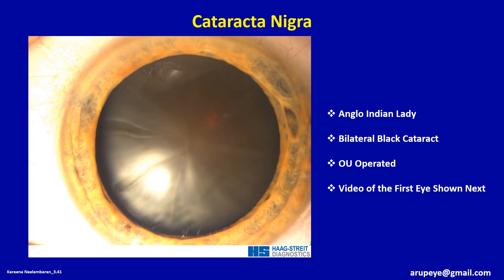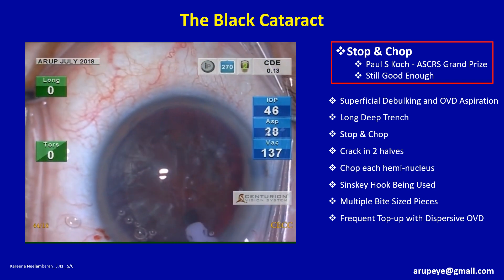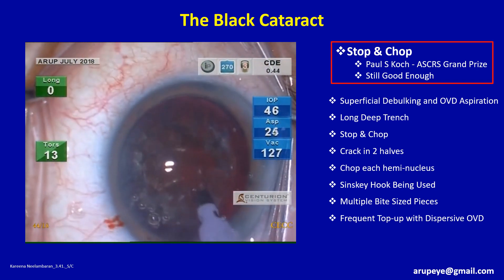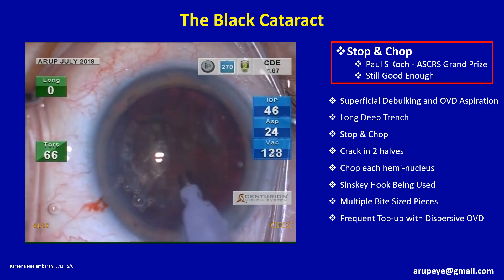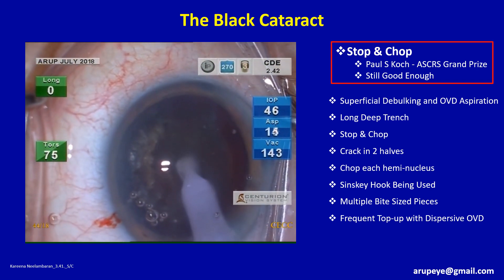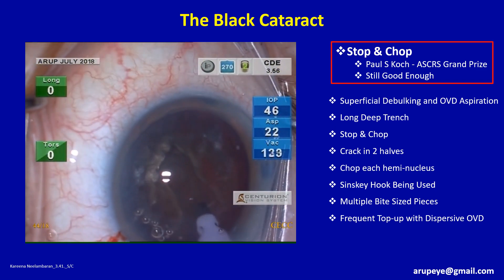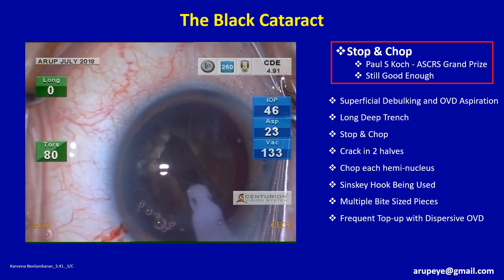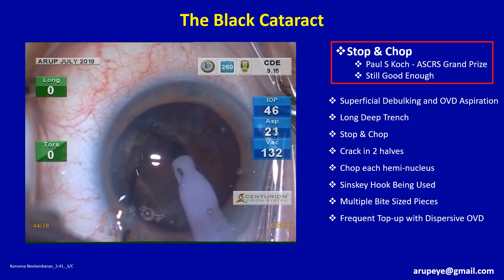This patient was an Anglo-Indian lady with bilateral black cataract. She successfully underwent phaco in both eyes. The superficial lens matter along with the overlying OVD are removed to start with. A deep, rather long trench is sculpted. Torsional phaco cuts very efficiently, and in really hard cataracts such as this one, as high as 80% torsional phaco power may be needed. Once the trench is deep enough, bimanual cracking is initiated from the periphery of the trench since cleavage is relatively easier to achieve at the peripheral location.